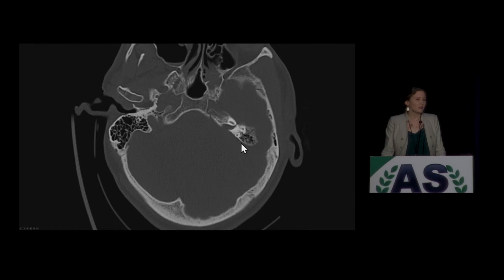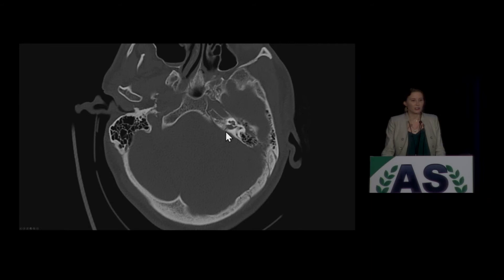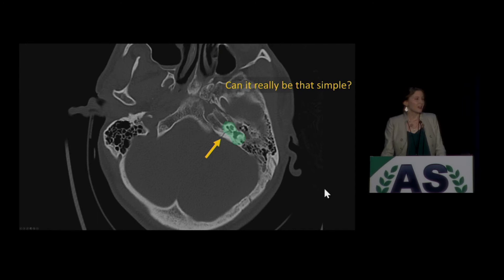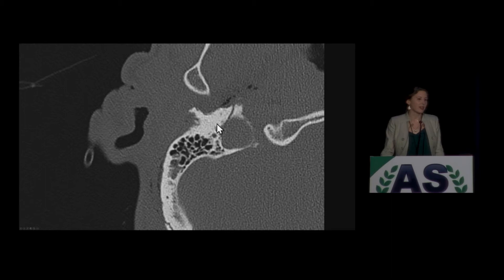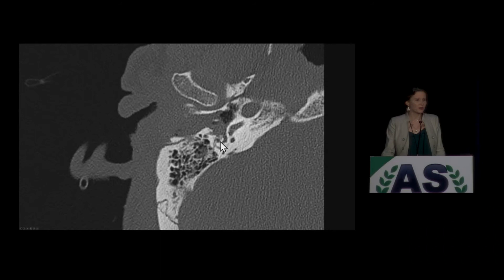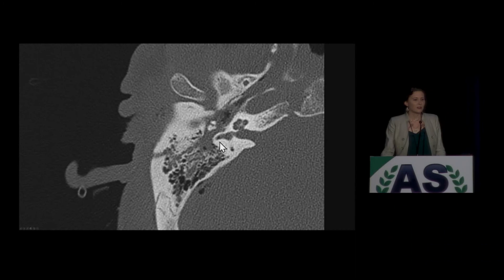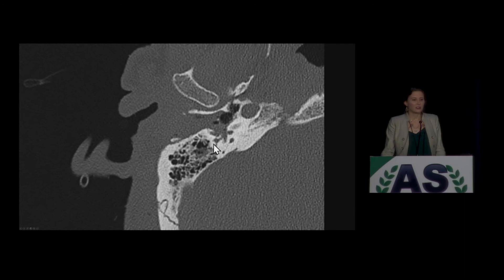All right, we're going to take the training wheels off — no more arrows. We have a fracture over here coming all the way across — this is a transverse temporal bone fracture. But this one is going right through the middle of this white structure right here. Therefore, this is an otic capsule involving or disrupting fracture. Can it really be that easy? It is that easy — that really is it. This is the hardest case I could find in my whole collection. There is a fracture right here — a transverse temporal bone fracture. As we scroll through, it is involving just this little edge. There's a little bit of air in this semicircular canal. This one is scanning the extreme edge of the otic capsule on that lateral margin, but it's still going right through the white part. So this one is an otic capsule violating fracture — that is as hard as I can make it.